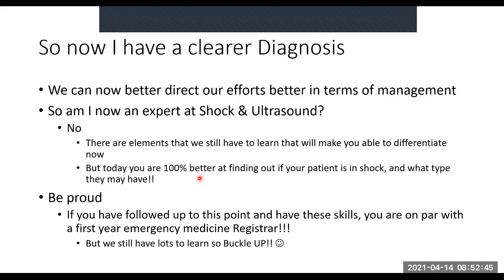So if you guys have been following these lectures from the start and you have these lessons ingrained into you and you've been using the machine, you should be very proud. You really should be very, very proud. You are now on par with the first-year emergency med registrar. Somebody who's written their primaries, done ACLS, ATLS, PALS, AMLS, neonatal, all of that, right? You're on par with them, all right?